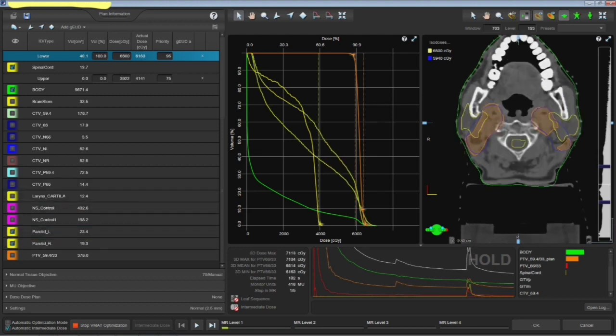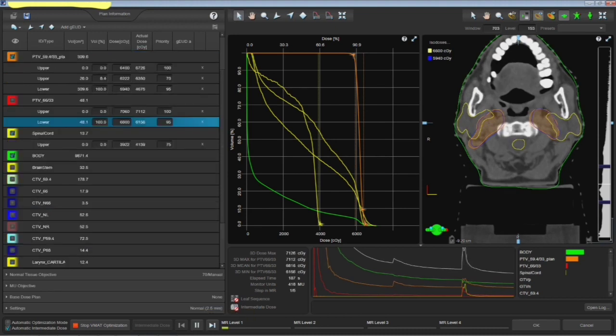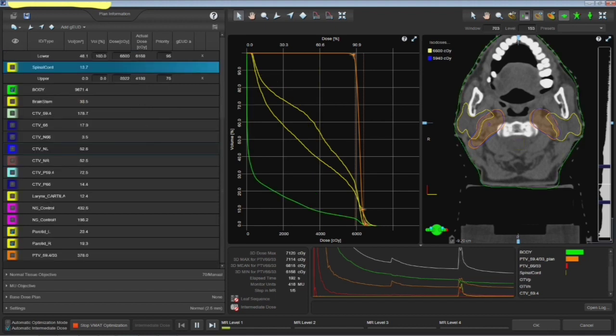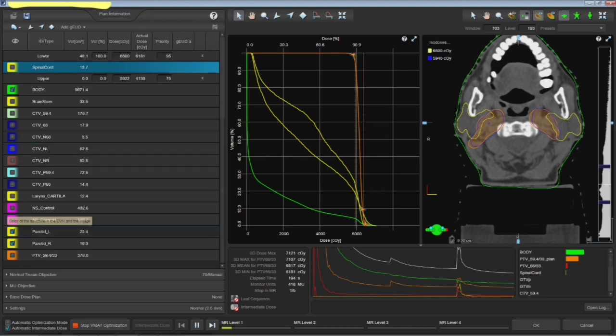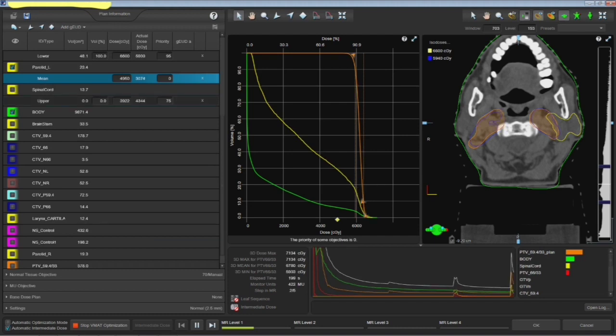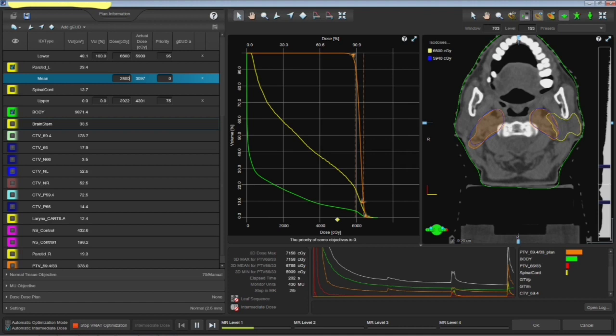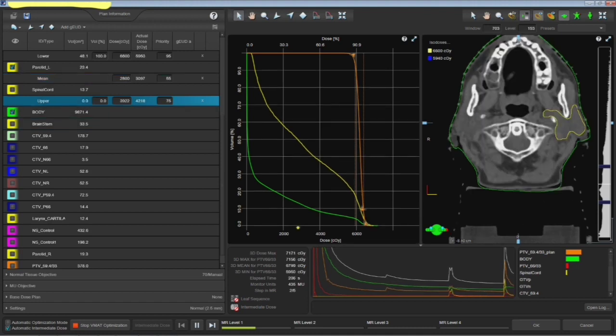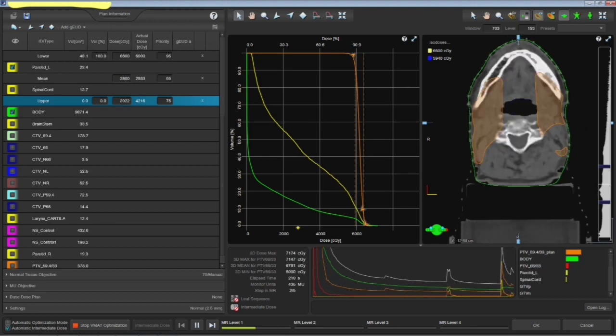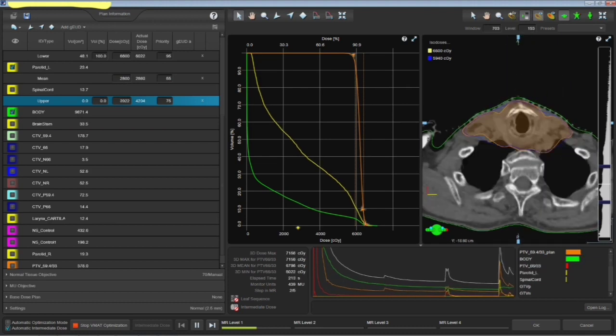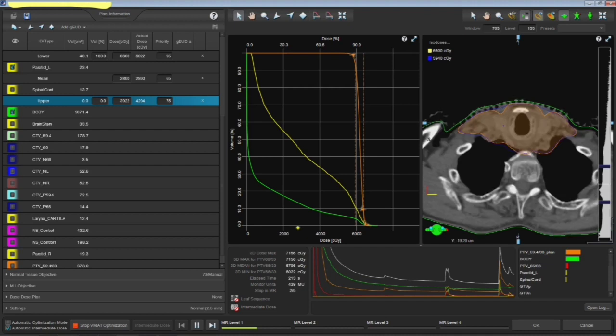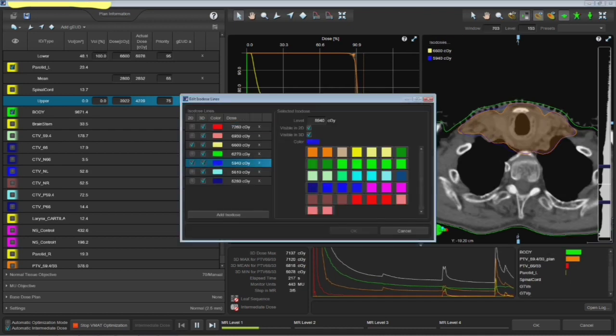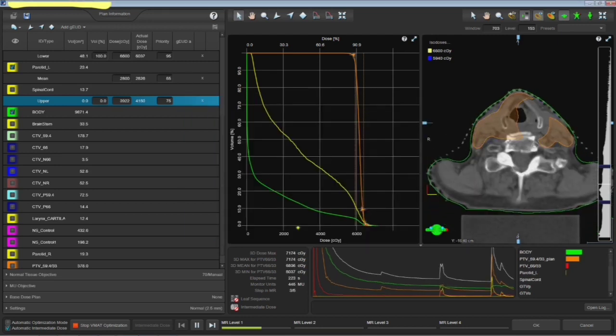And the spinal cord has been, now it's okay. Now parotid, just understand the vicinity of the parotid with respect to the nodes. Just keep the mean dose and then see how much it's already going and how much it's already receiving it, and accordingly look at the distribution and then change the dose and the priorities. You don't need to rush it, you just see there first.